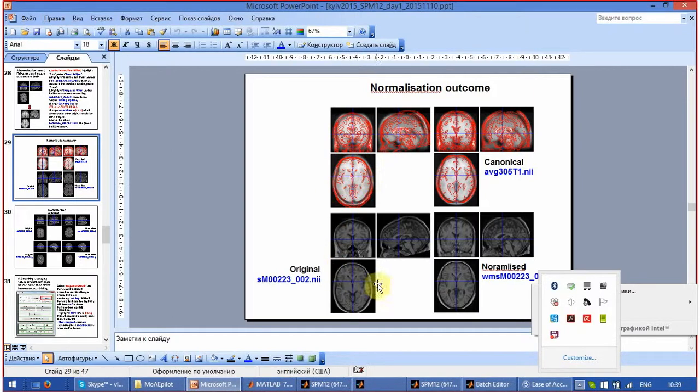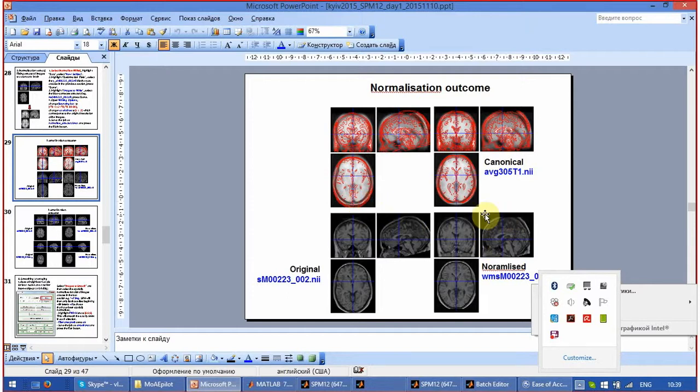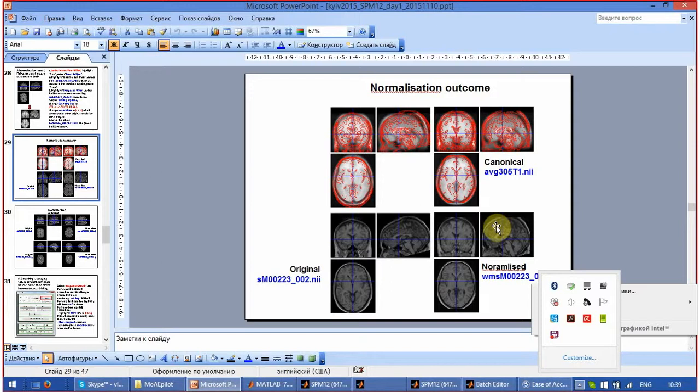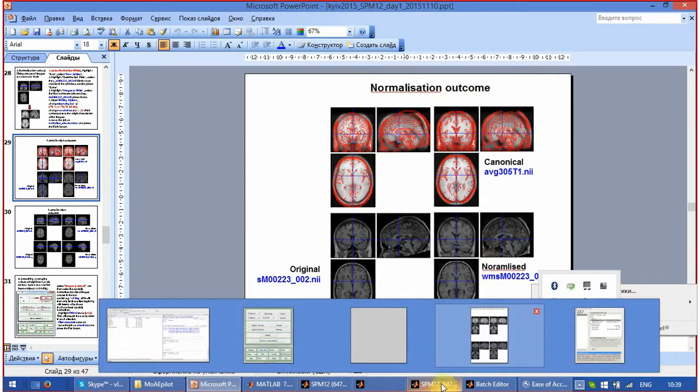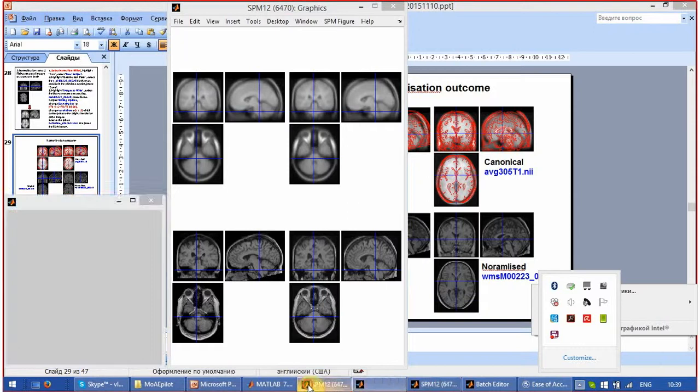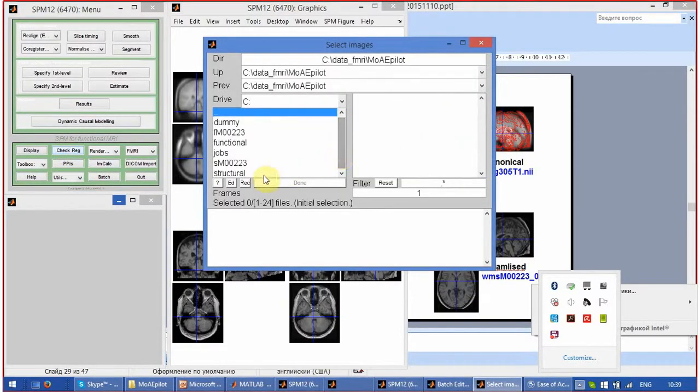Typically before the normalization, they don't fit the canonical very well, just approximately, and after normalization the deformations were applied so that the correspondence between the canonical and the normalized image is maximum. Let's check it using the Check Reg button. Go to canonical and pick the canonical image after.